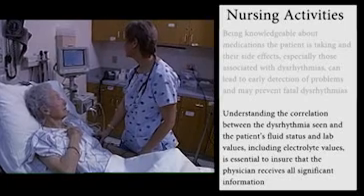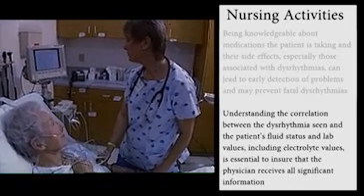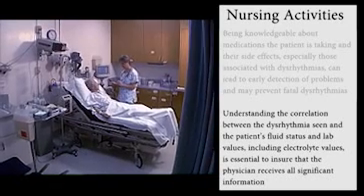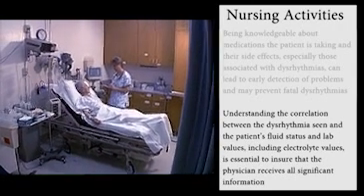Understanding the correlation between the dysrhythmia seen and the patient's fluid status and lab values, including electrolyte values, is essential to ensure that the physician receives all significant information upon which appropriate treatment of underlying pathologies will be based.